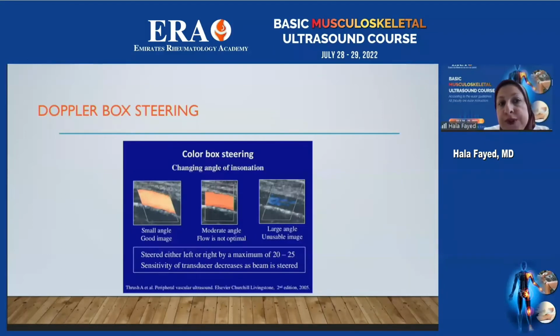Another important thing: we can use the box as a rectangle, but sometimes we can use steering as a method instead of the insonation angle. So we use the steering method, as if we are inclining the ultrasound beam.